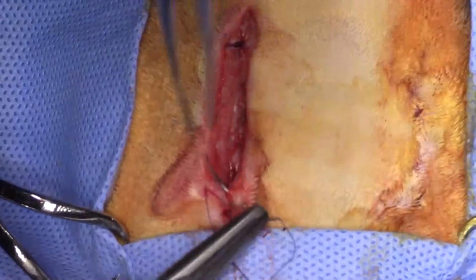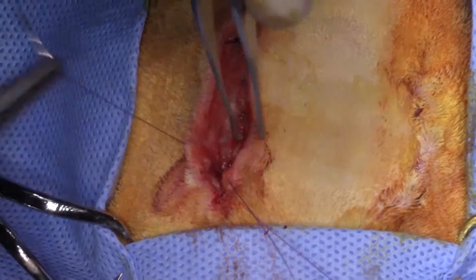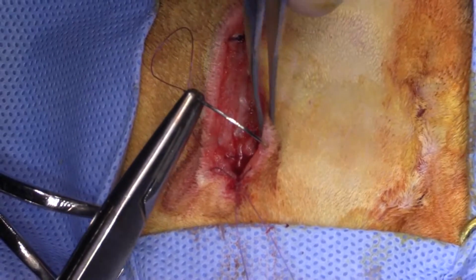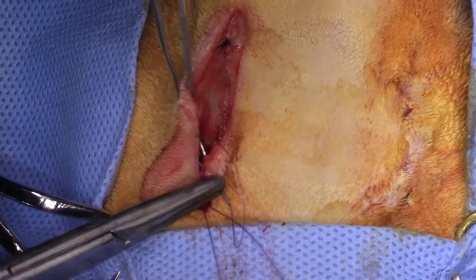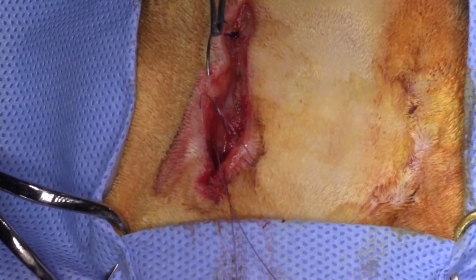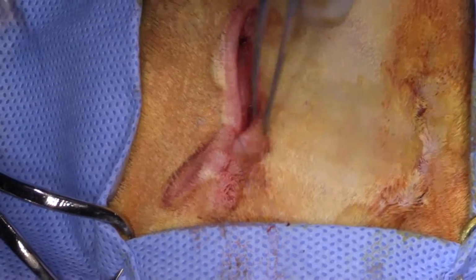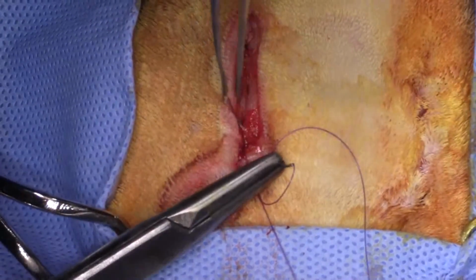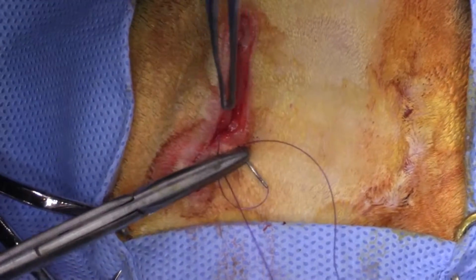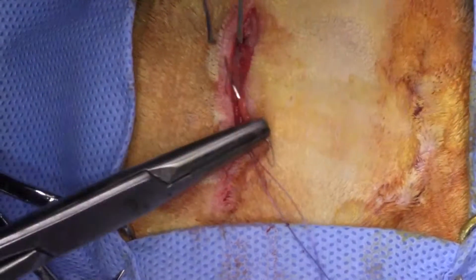Now, right adrenal masses are trickier than left ones because, first off, they're farther cranial in the abdomen, so they're up underneath the liver. And second off, they're right underneath the vena cava. Whereas left adrenal gland tumors are quite lateral and are not underneath the vena cava, right ones are right underneath the vena cava, and often they're a little bit adhered. And so what we do is we get a Satinsky clamp and grab onto the vena cava and elevate it while we dissect the mass from the dorsal surface of the vena cava. So hopefully I'll be able to live stream that.